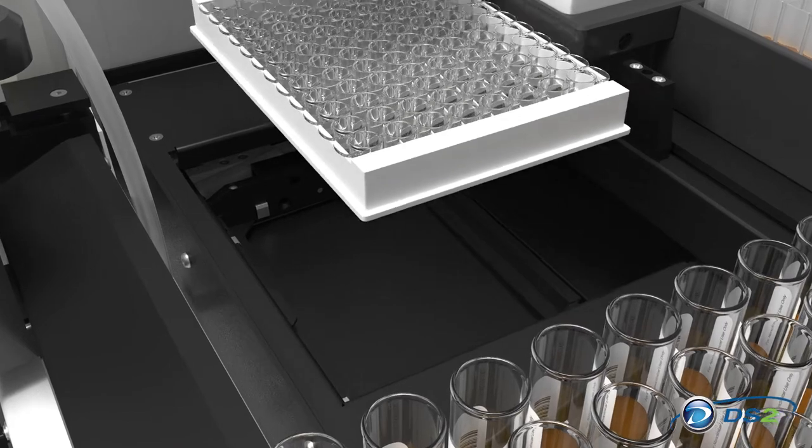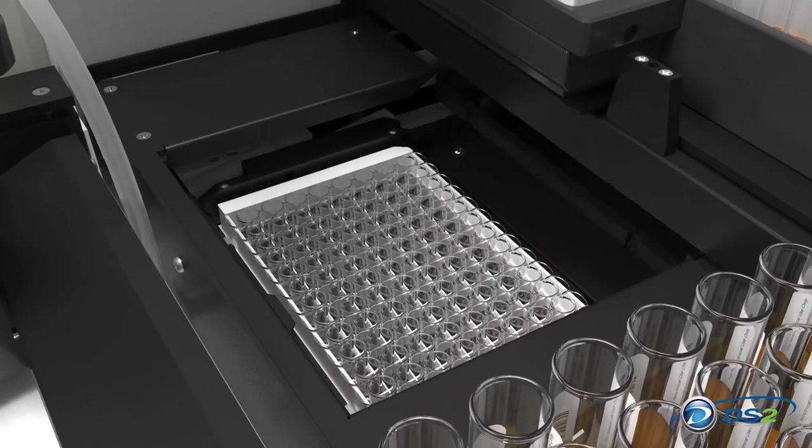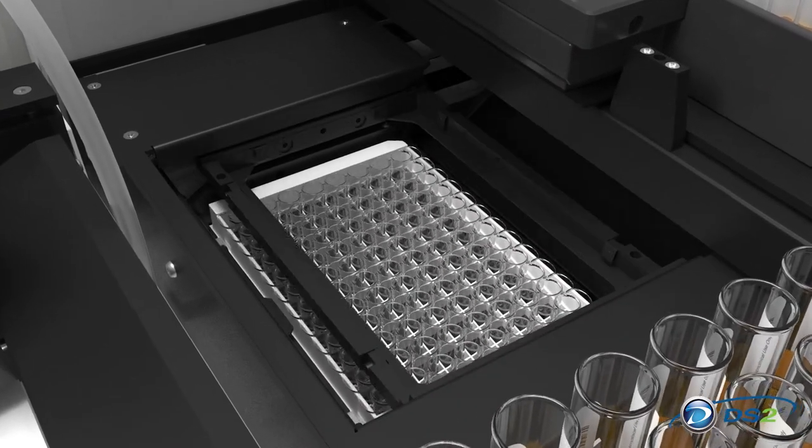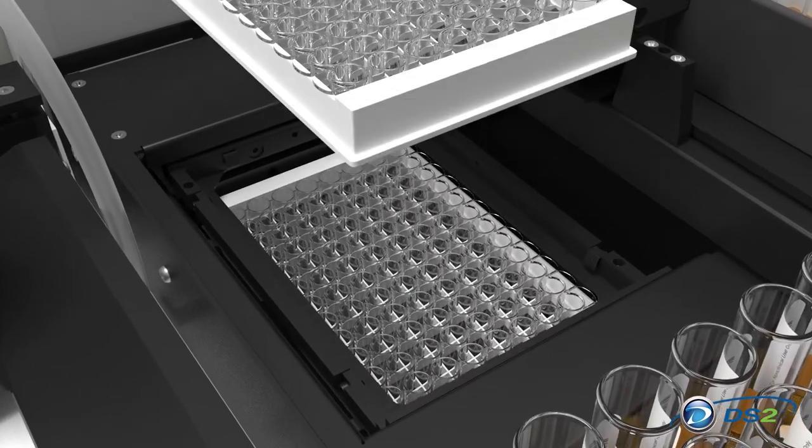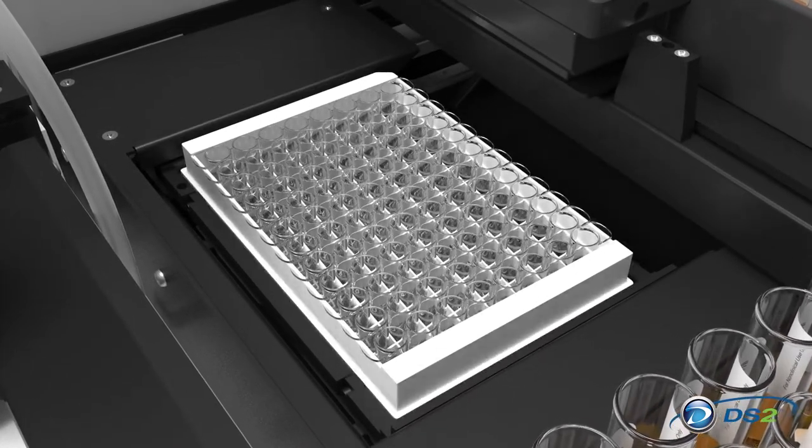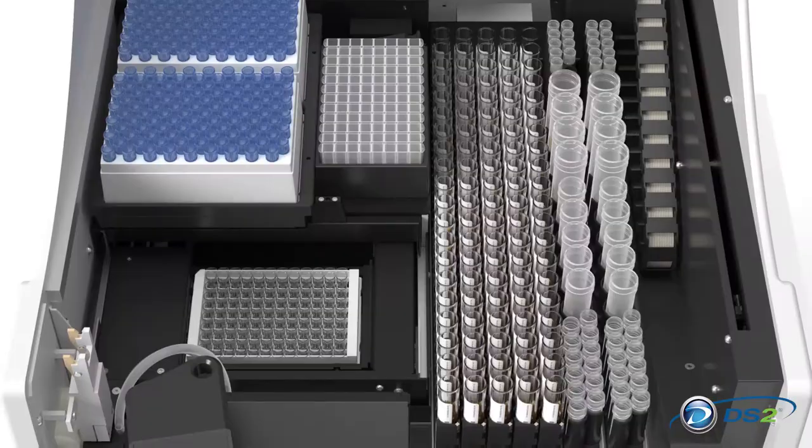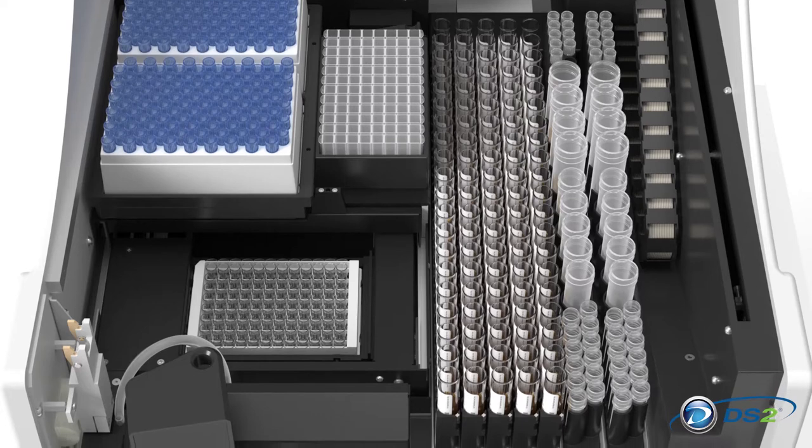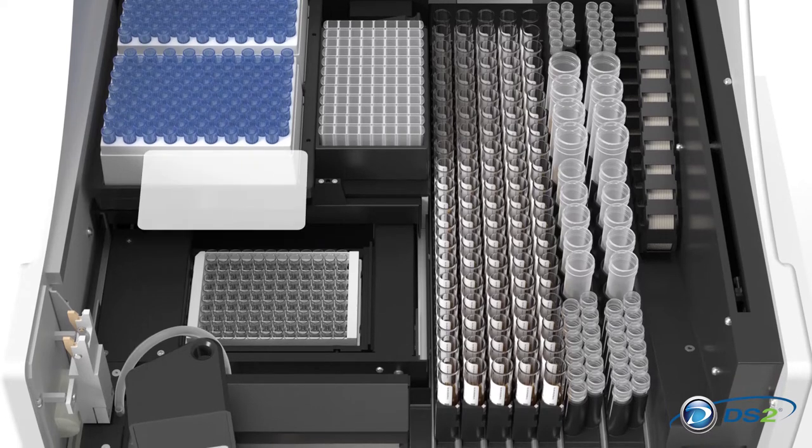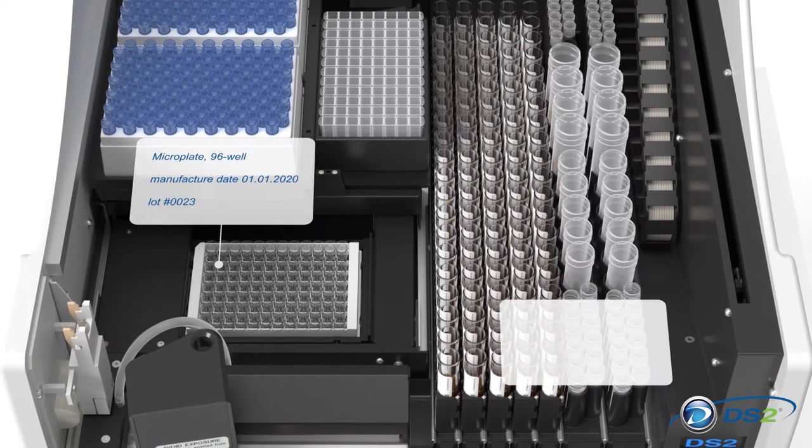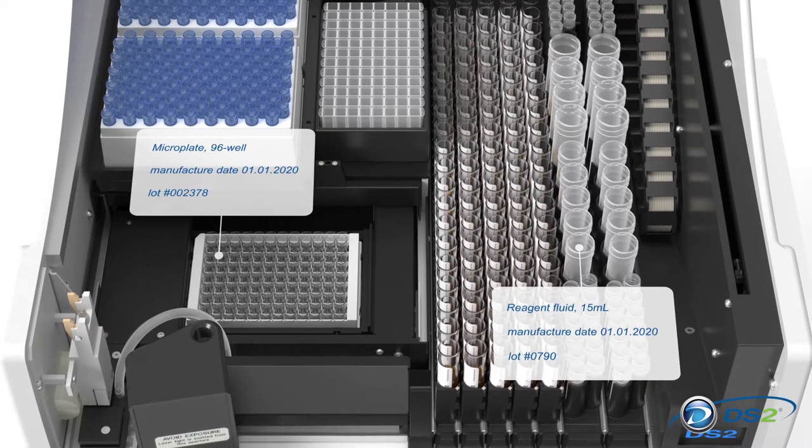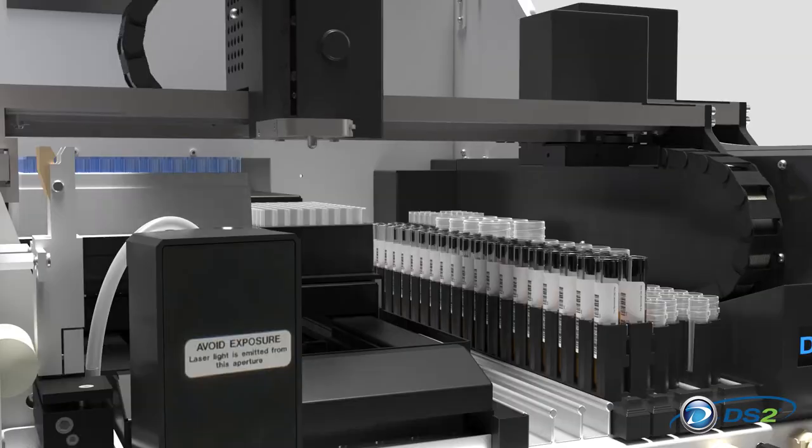An innovative multi-plate carrier and incubator holds two 96-well microplates. The DS2 enables traceability of lot-specific data for plates and reagent consumables.